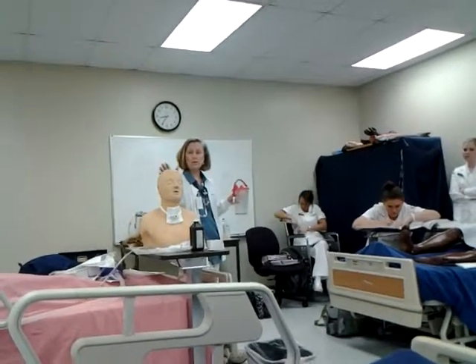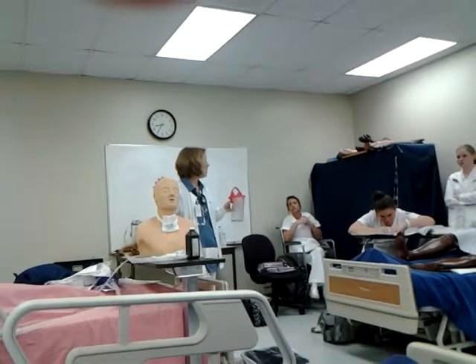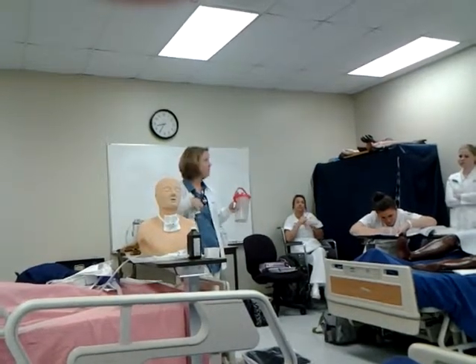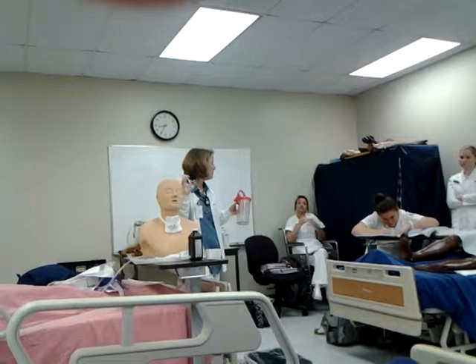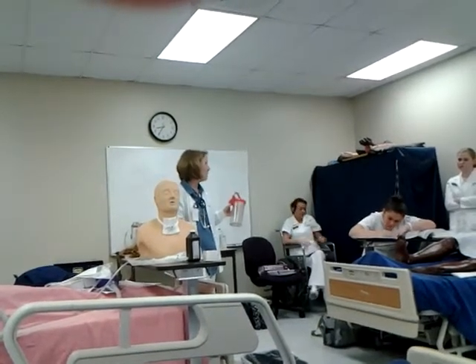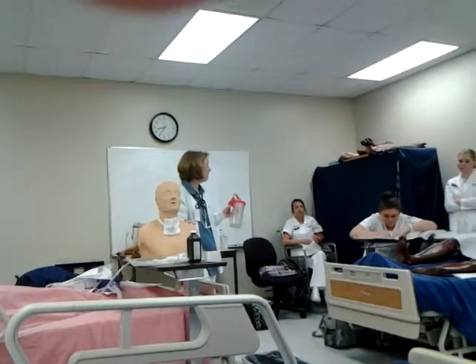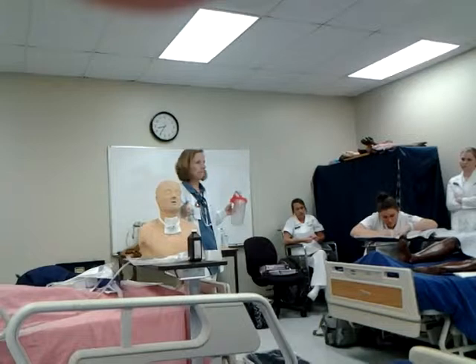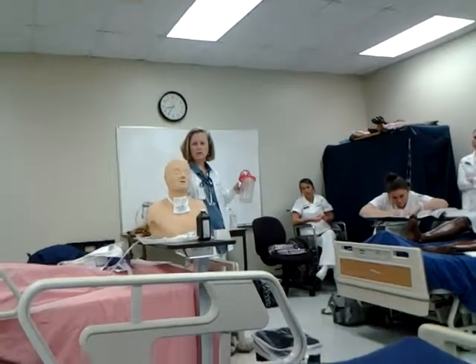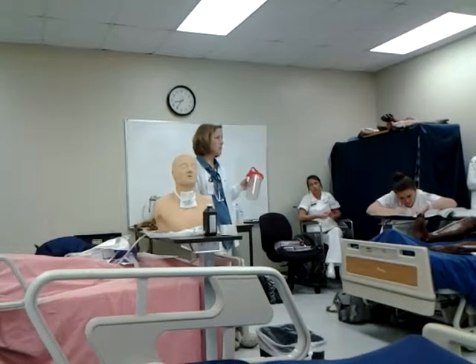And certainly I would document that patient's respiratory status. Once I suction him, then I'm going to listen to his breath sounds. I'm going to look at his color. I'm going to check his respiratory, looking and feeling. Do you think this is uncomfortable for the patient? Yes. Sometimes patients may need to be premedicated, especially new trachs.